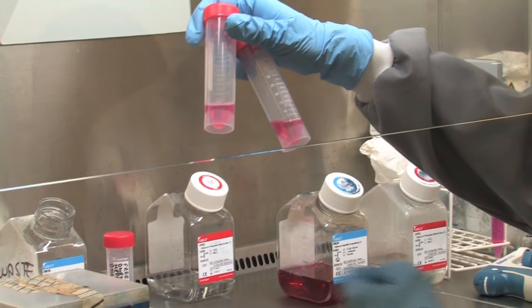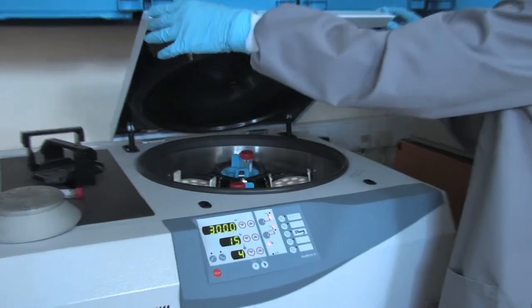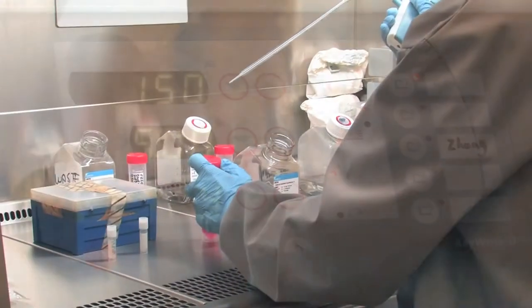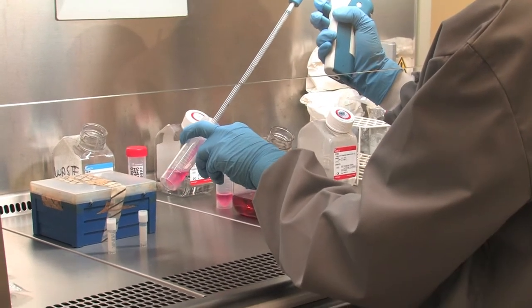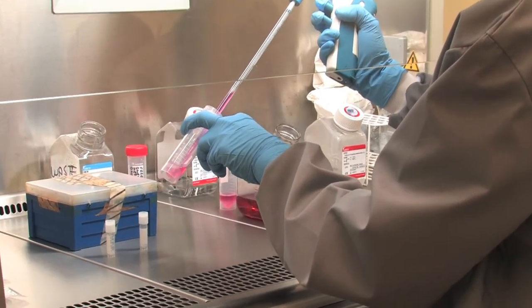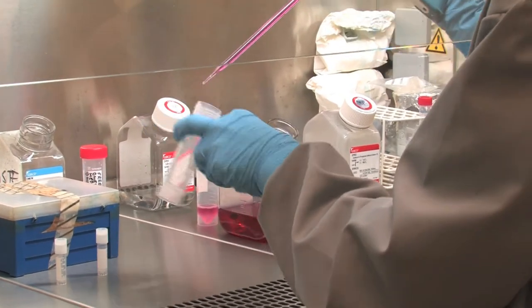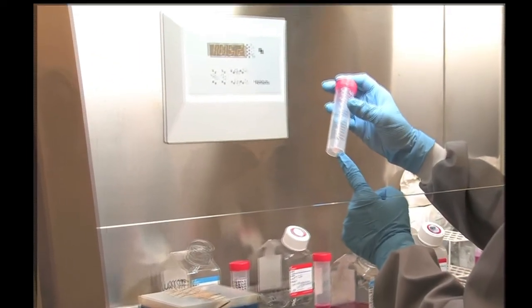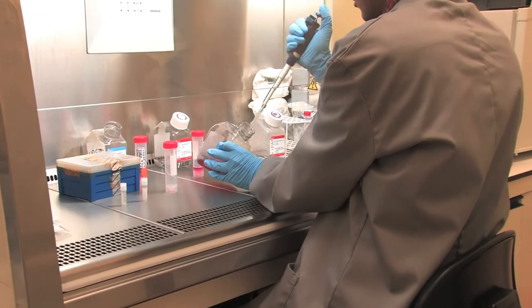In order to pellet the cells at the bottom, the tubes are centrifuged at 150g for 5 minutes. The supernatant is carefully removed. Special care should be taken not to disturb the cell pellet at the bottom. The remaining cell pellet is re-suspended with 0.5ml of complete growth media.